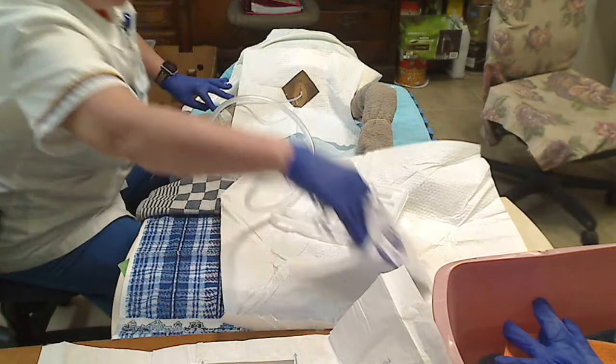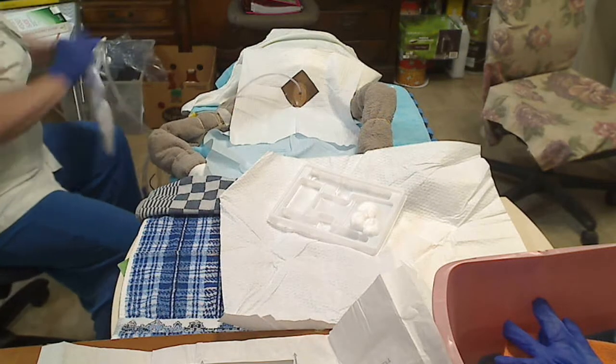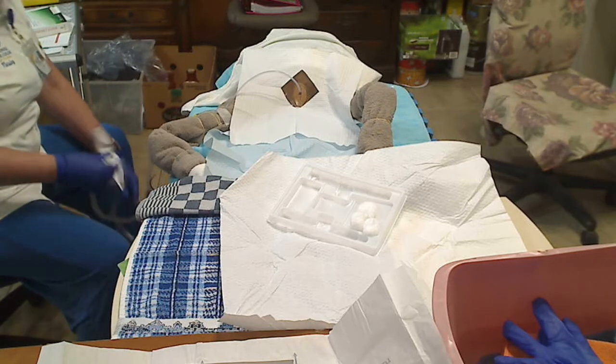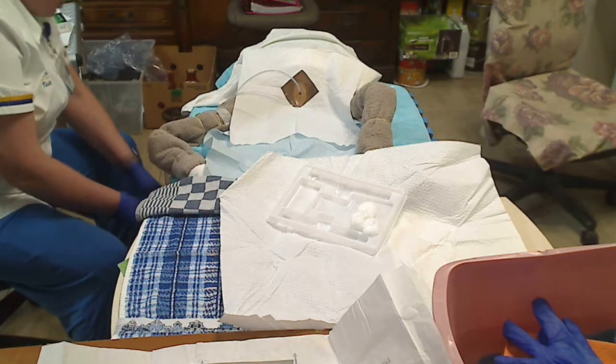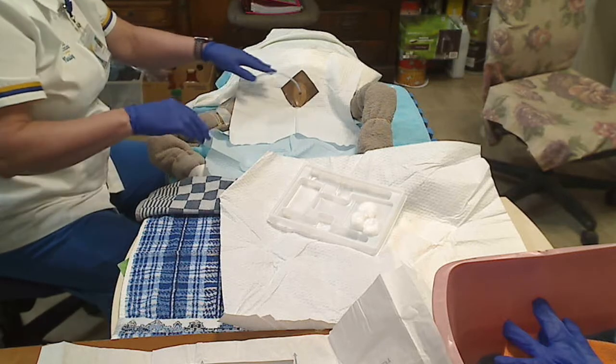I'm going to make sure that the bag is hung properly below her height so that it does drain properly. And I do have a hook down here below the bed. I am starting to notice a flow of urine coming through, so this is good.